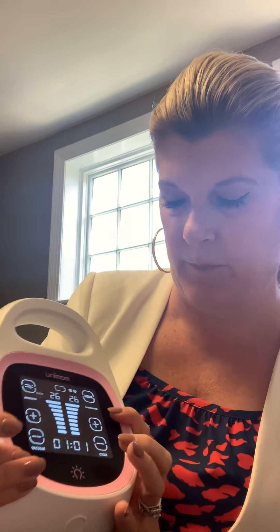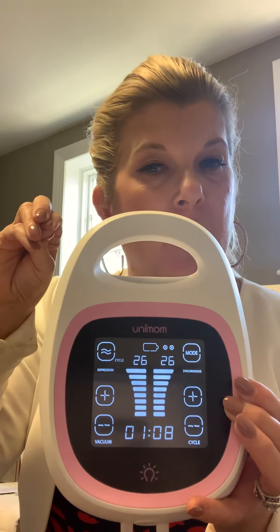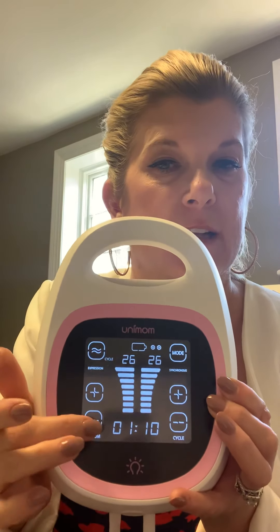For your expression phase, you can also set your vacuum strength and your cycle speed. Your vacuum strength is how much pull there is, and the cycle speed is how quickly. You always want to start with the lowest setting that's the most comfortable.